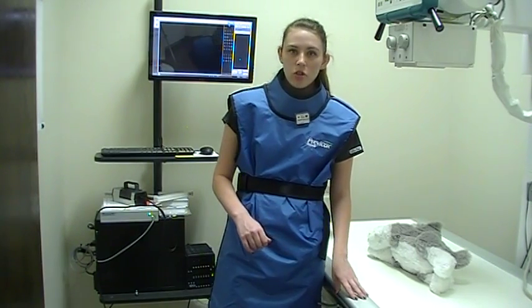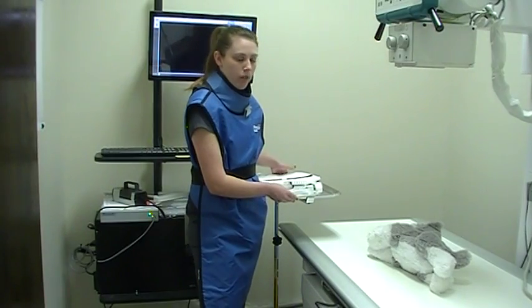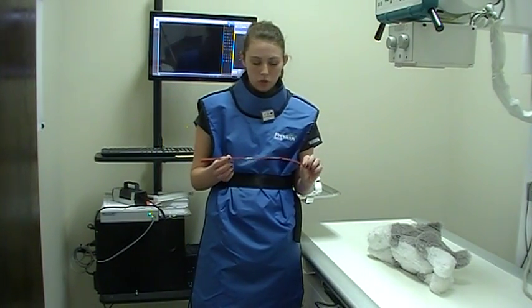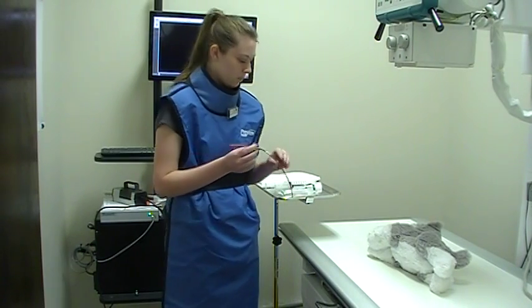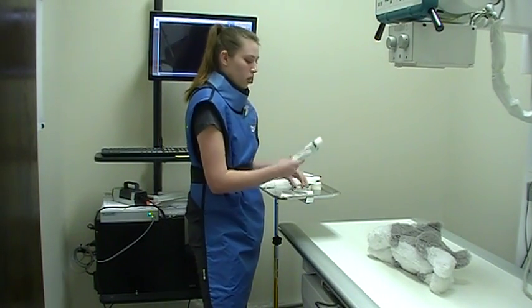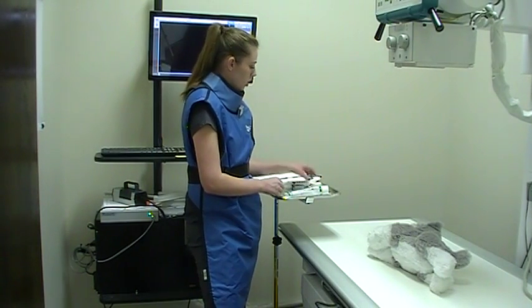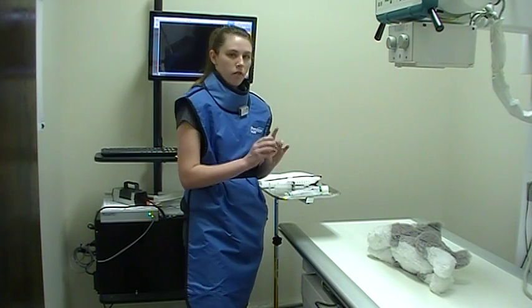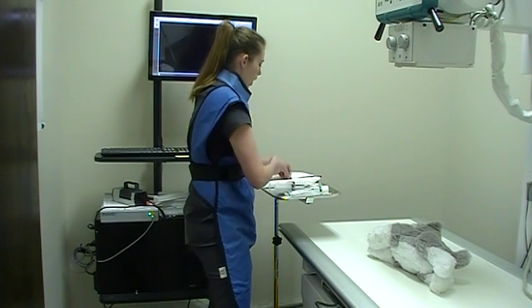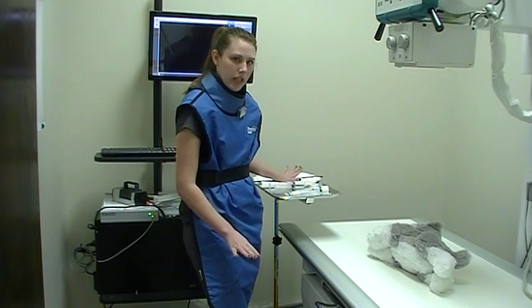The first thing we're going to do is make sure that we have all of our supplies and materials ready for the study. I have a red rubber catheter which is just going to be our gastric tubing. I have our lubricant and our syringes filled with barium and water. I have a one inch roll of tape which will act as our mouth gag, and I have a towel for any cleanup because barium can be particularly messy.